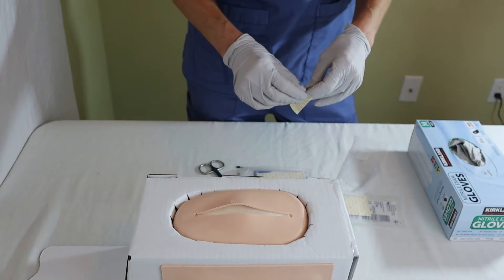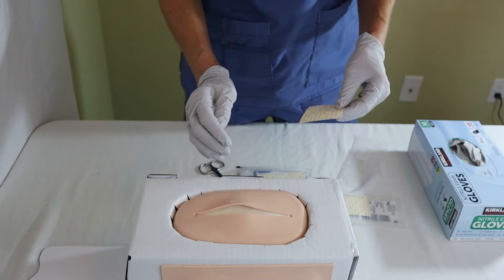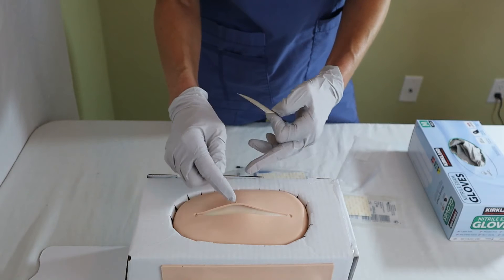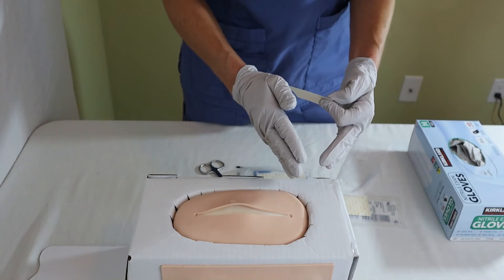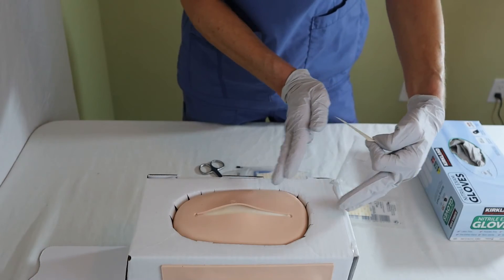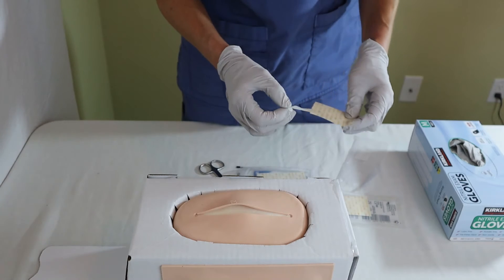The key is that you start on one end of the wound and work your way to the other end. Sometimes in a case where there's a little bit of an opening, it might help if you put one strip on each end and then one in the middle — otherwise you might push the opening toward one end or the other.